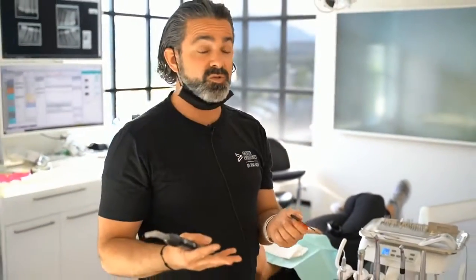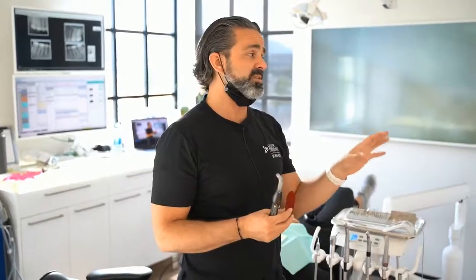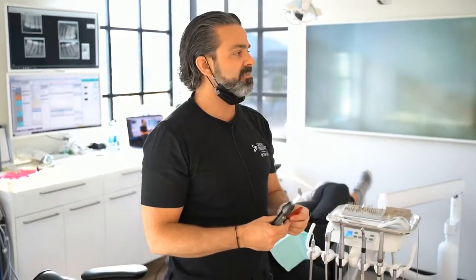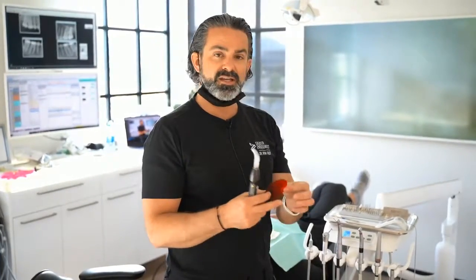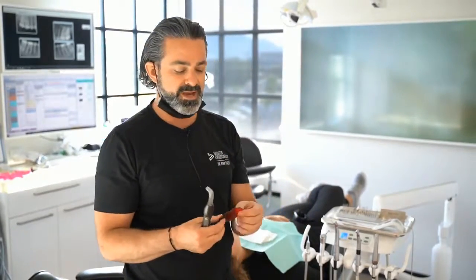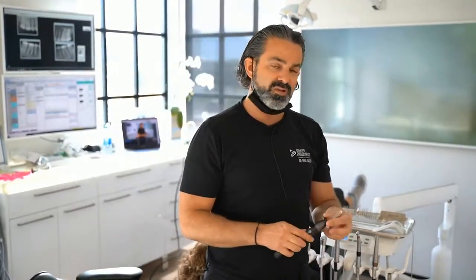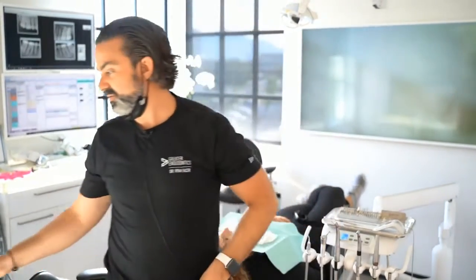I still do indirect a lot with a mirror, so the microscope isn't taking indirect vision away from me, as long as you're comfortable with the mirror. That was never an intent in my mind, but I can position and hold that, and if I need to move to another room, it's still there when I come back, and I get away from those filters. So those are really good assets to the microscope.